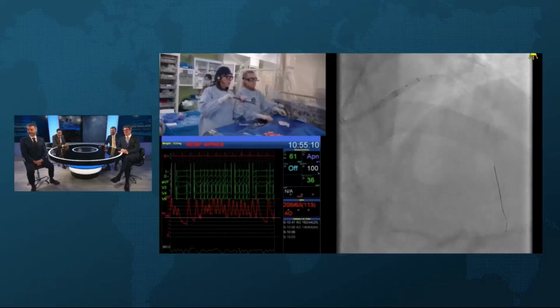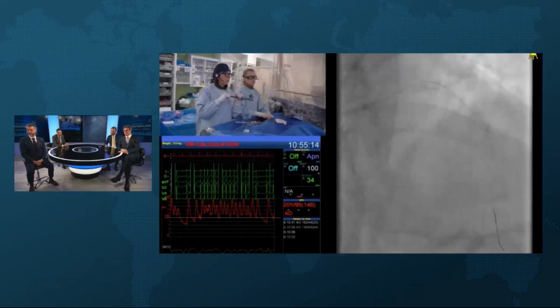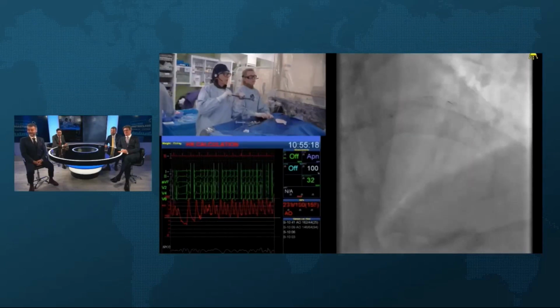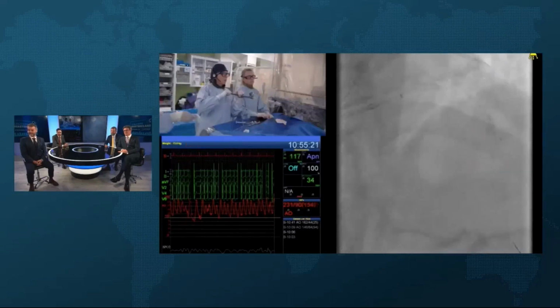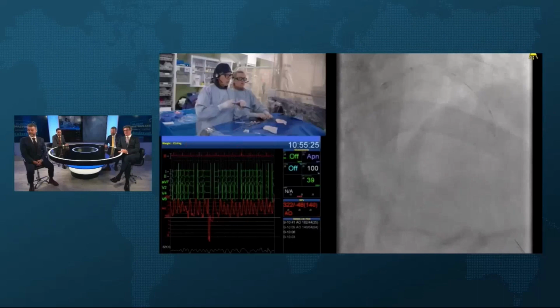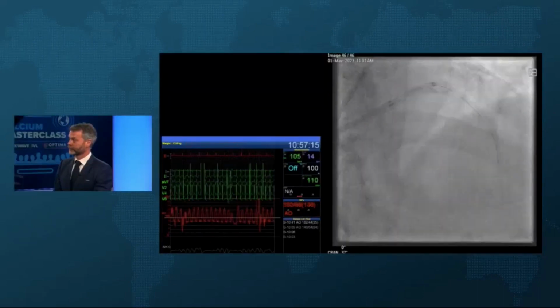What's your wire? These kinds of cases, as far as it goes on. Nice. Very good. Nice work. Okay, good. Well done. Very good. Nice. Beautiful. Okay, we're going to go there. Just not too hard. This is an NC, is it? A 3.0. Okay.